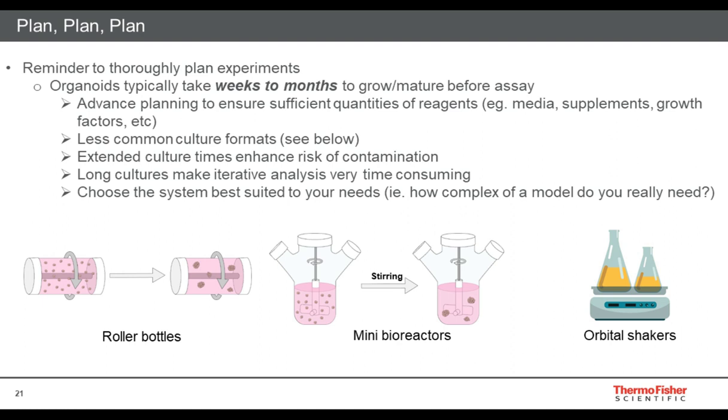And also considerations between adult model systems and pluripotency or PSC-derived model systems. The level of maturation of cells may be something that one has to reckon with and decide, how mature is enough for your study, and those sorts of considerations.